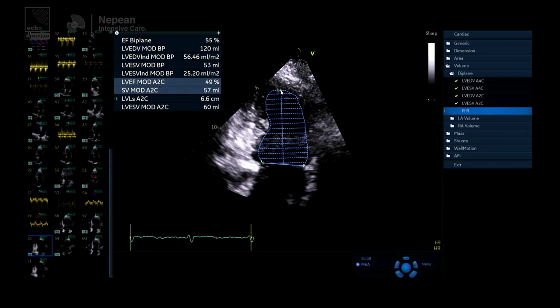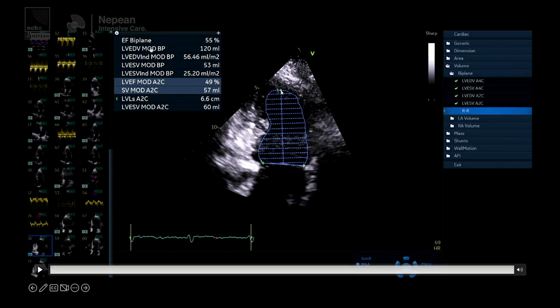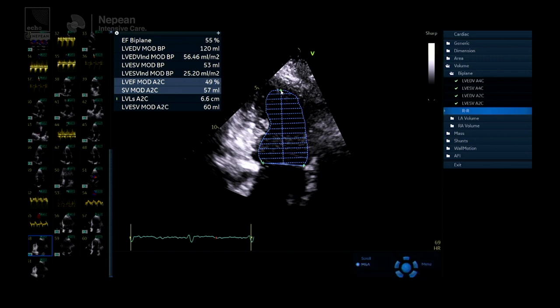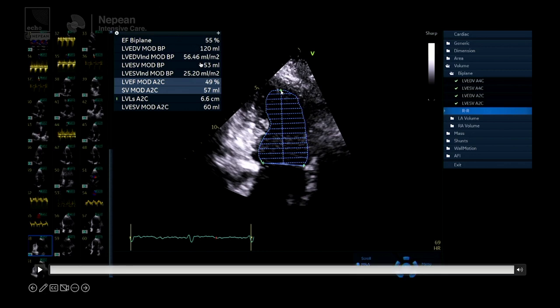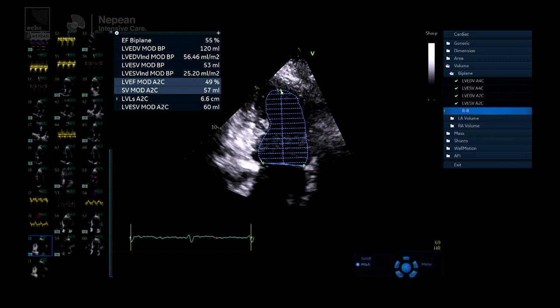The values generated take into consideration what Louise did in the four chamber. It gives an end-diastolic volume and a left ventricular end-systolic volume — method of discs biplane — and uses the difference to give stroke volume over end-diastolic volume, which is ejection fraction. So that would be 120 minus 53 over 120, giving an ejection fraction using Simpson's biplane of 55. That's how it would be done.